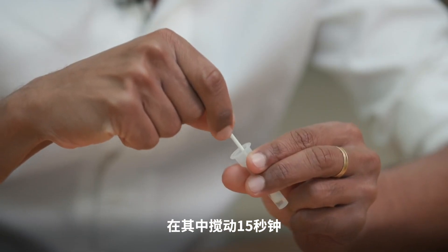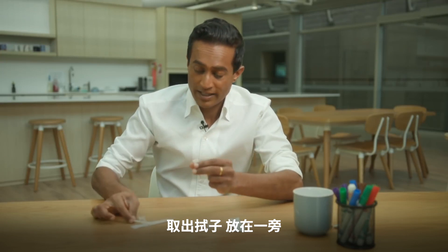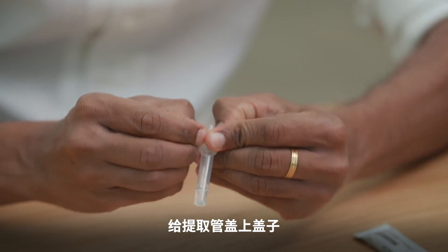Then place the fabric tip into the liquid in the extraction tube. Roll it around inside for 15 seconds. Now take out the swab, set it aside, and put the lid onto the extraction tube.